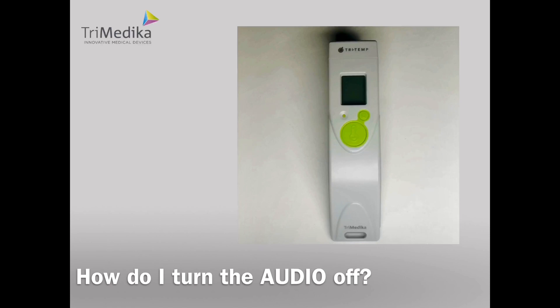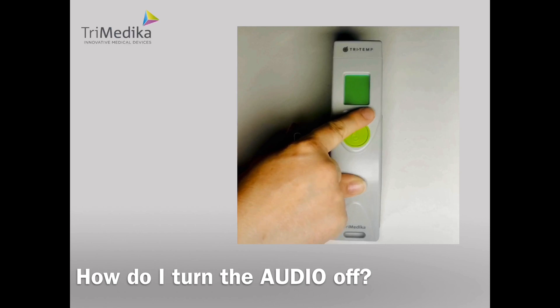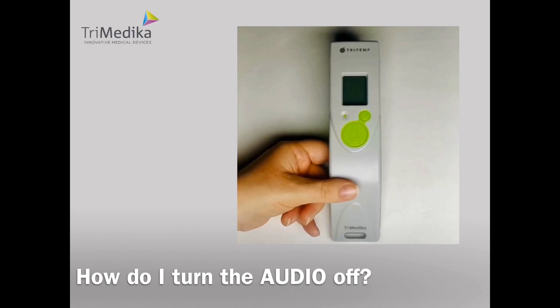Let's work through an example. I have a dementia patient who does not like the sound of beeps. How do I turn the audio off? Hold the power button until it beeps. Press OK to select Celsius, and we can see that audio on is flashing — this is the mode that we want to change. Use your pointed object to press the up button and you will see the word off. Press OK to confirm your selection. Press OK to remain on the body setting. Press OK if the offset is at 0.0, and this will bring you out of the settings mode. You have successfully turned the audio off.